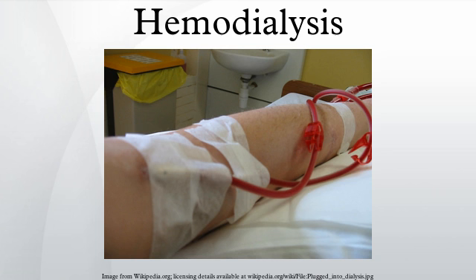Membrane flux and outcome. Whether using a high-flux dialyzer improves patient outcomes is somewhat controversial, but several important studies have suggested that it has clinical benefits. The NIH-funded HEMO trial compared survival and hospitalizations in patients randomized to dialysis with either low-flux or high-flux membranes. Although the primary outcome did not reach statistical significance in the group randomized to use high-flux membranes, several secondary outcomes were better in the high-flux group. A recent Cochrane analysis concluded that benefit of membrane choice on outcomes has not yet been demonstrated.